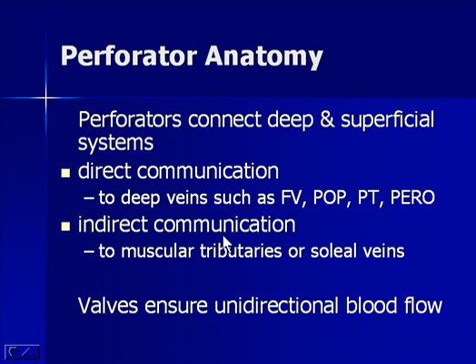Okay, what about perforators? Well, perforators are small veins that connect the deep and superficial systems. Sometimes they directly communicate with the deep systems, such as the popliteal, peroneals, posterior tibials, or femoral vein. They're a straight shot through to those named veins. And sometimes they're actually just vessels that connect into various muscular tributaries or even the soleal veins. But they all have valves, and they should have flow only in one direction.